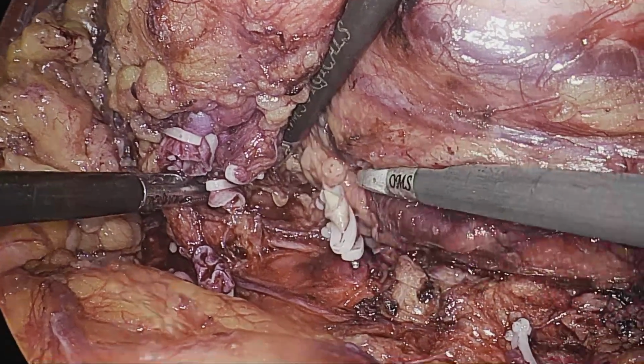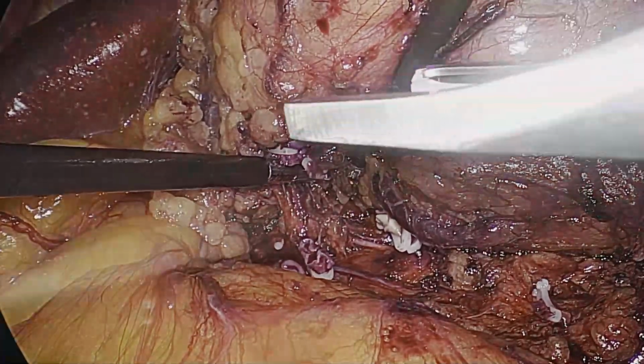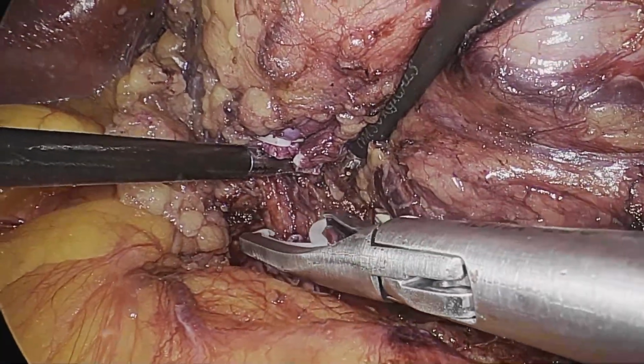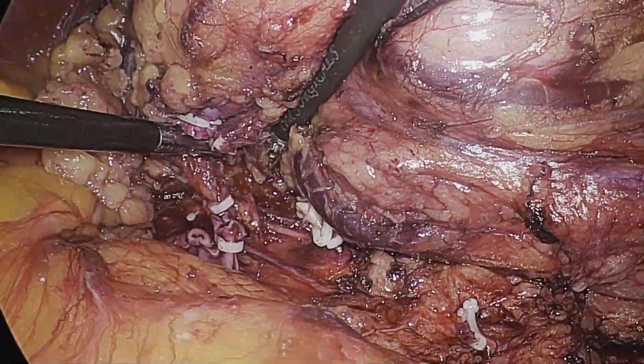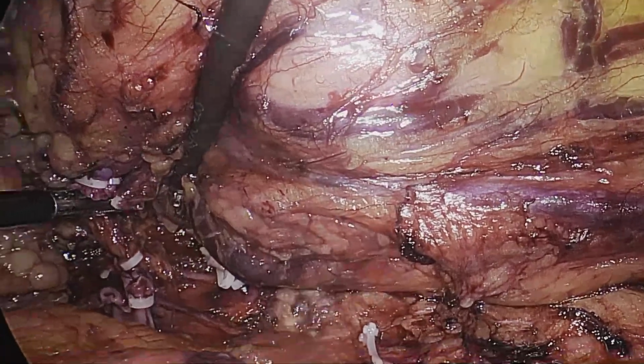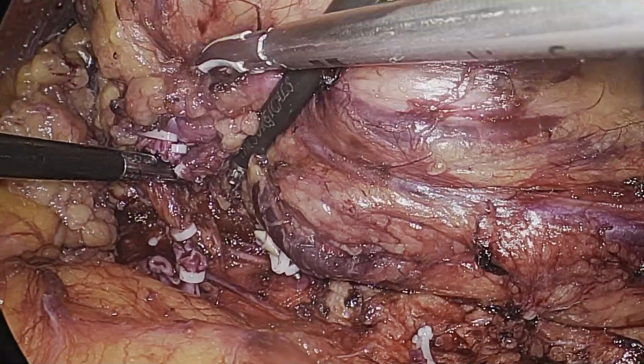See, as expected, the renal artery is showing a plaque inside. Another clip at the lymphatics to prevent the lymphatic leak, and the specimen will be separated from the hilum.